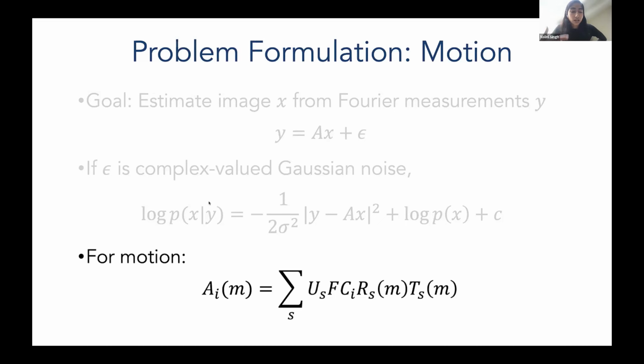And then we have the standard MRI forward imaging model as before. So we have our coil sensitivities, the Fourier transform, and then we have the undersampling operator, which describes which section of k-space was acquired during this particular motion state of the object.